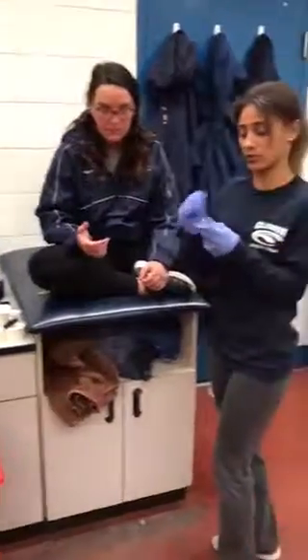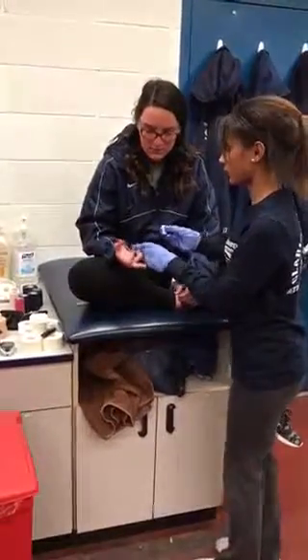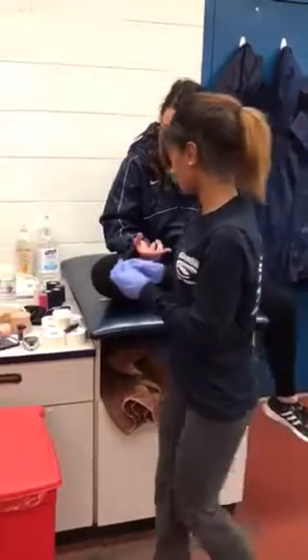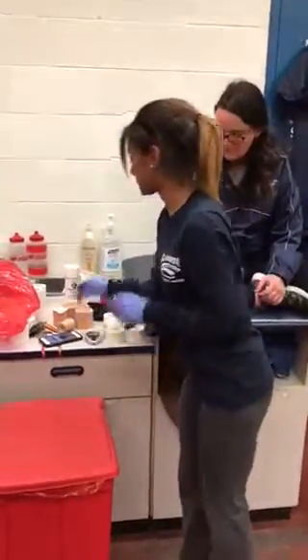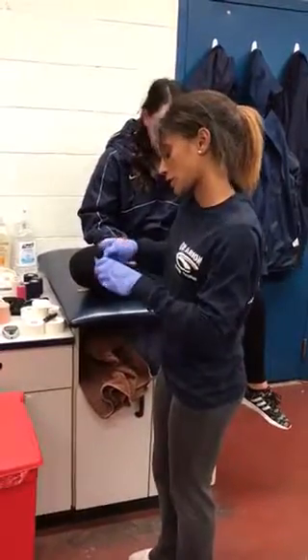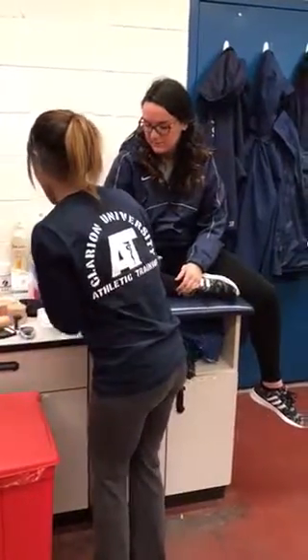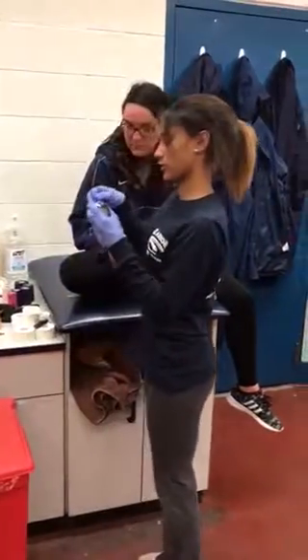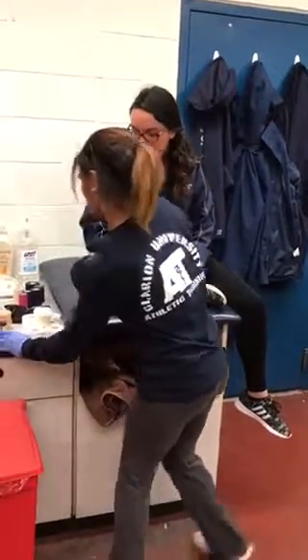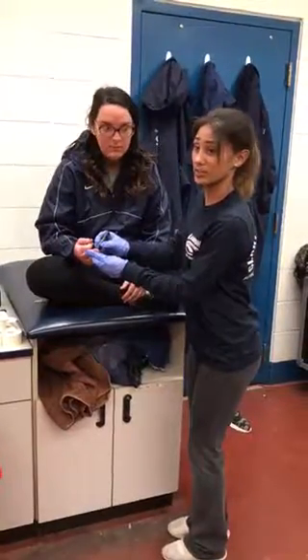So first I'm going to clean her finger with the alcohol pad. And then I'm gonna grab a test strip. And go ahead and put it into the glucometer and it'll turn on. And then from there, I'm going to click the button.